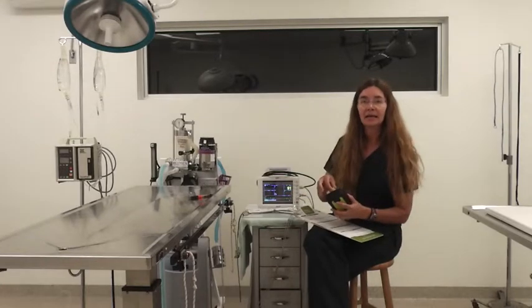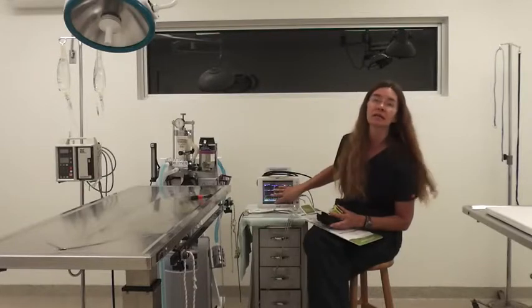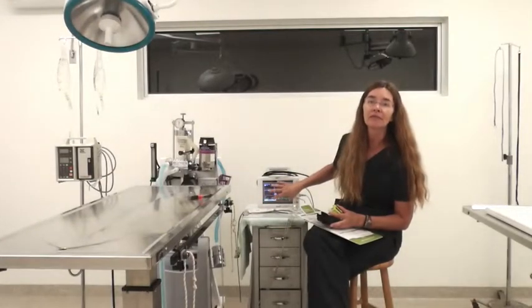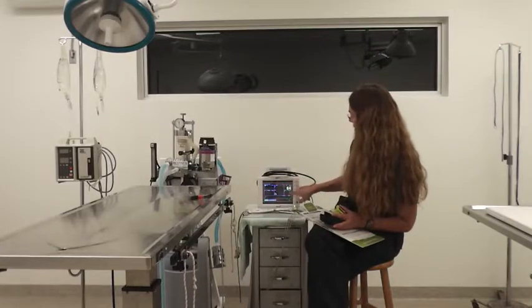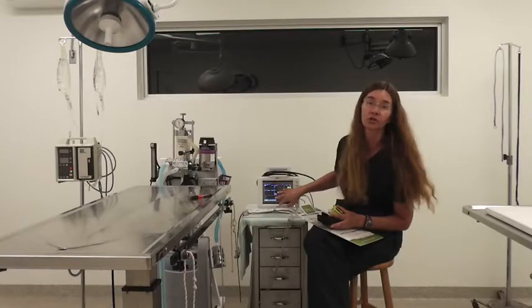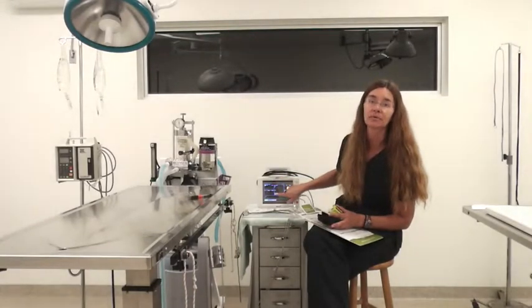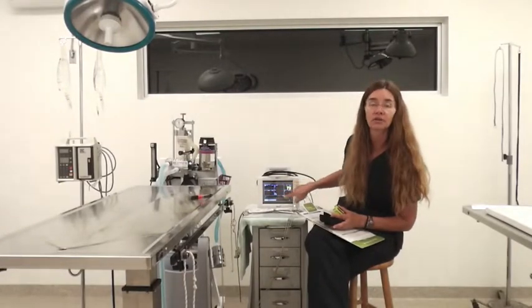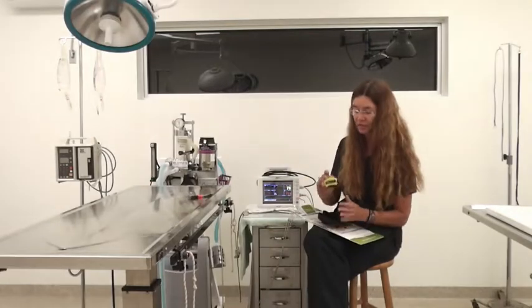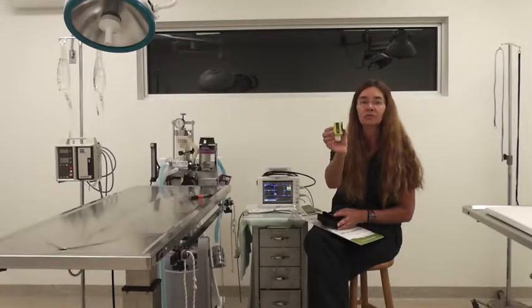We use the EMMA here. Our machine does have the function to do a mainstream or sidestream capnograph, and if we were to use that, we would see a waveform across our monitor, meaning that when the patient exhales, it would go up. That means they're exhaling CO2, and when they inhale, it would come back down because they're breathing in oxygen. So it would give us a waveform across our monitor, but we use the EMMA here that gives us respirations and CO2.